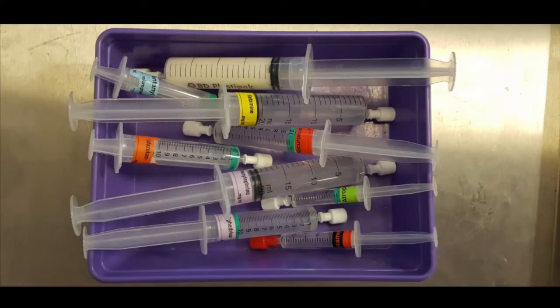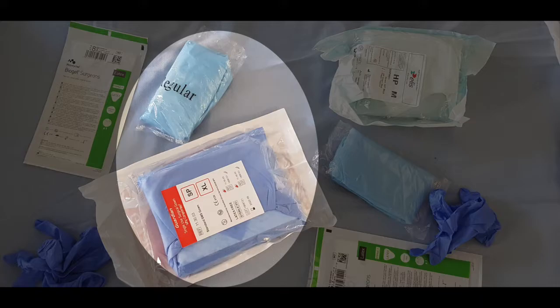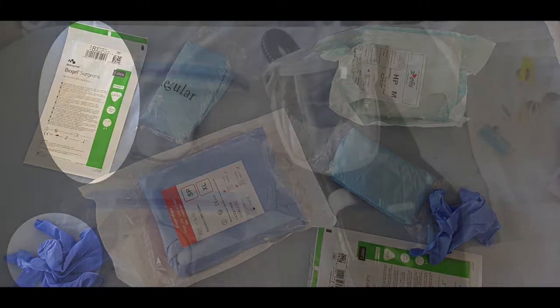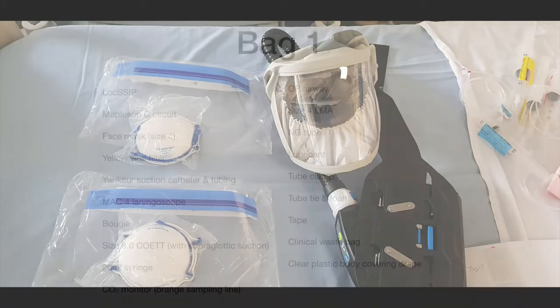Please use drugs that you are familiar with and will provide the best hemodynamic stability. Each person attending the intubation should wear 2 gowns, 1 pair of sterile gloves and 1 pair of non-sterile gloves. Ensure that you select the appropriate respirator depending on prior fit testing.